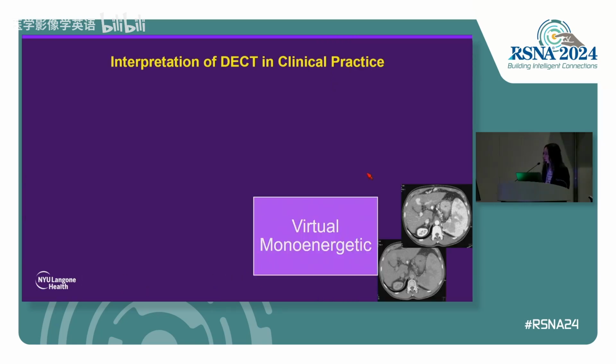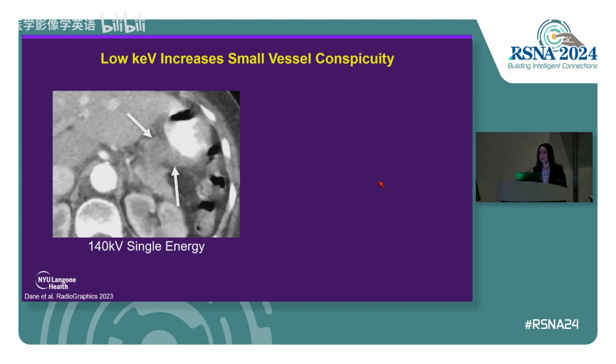So finally, virtual monoenergetic images. So as we know, iodine has a K-edge.